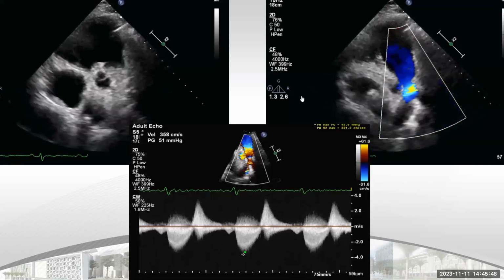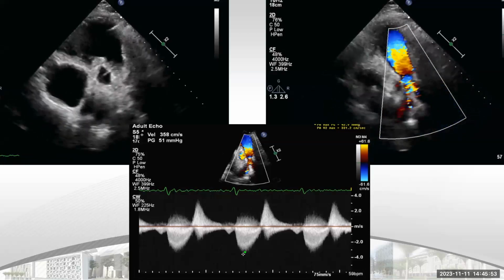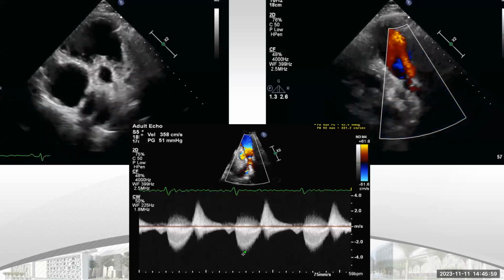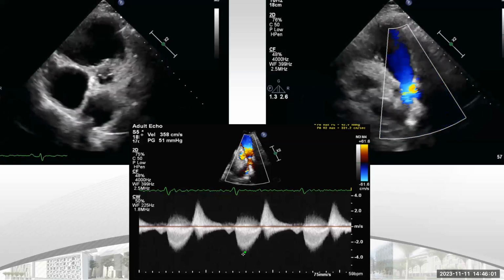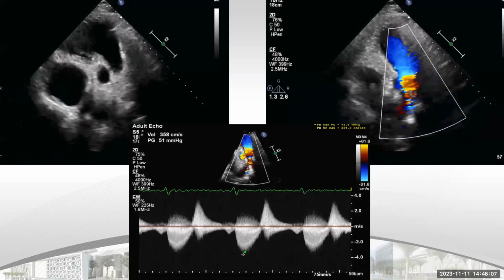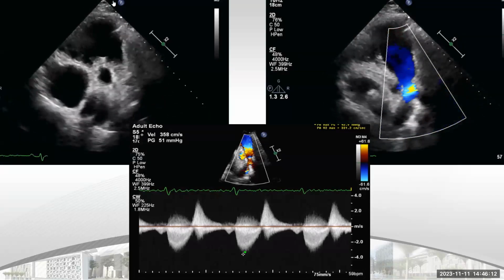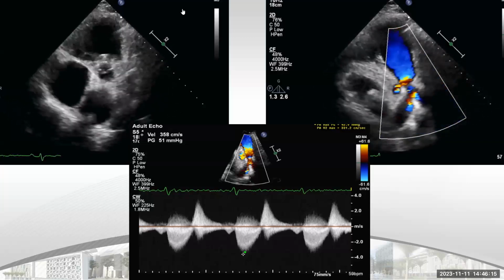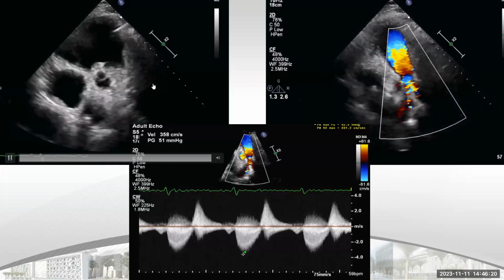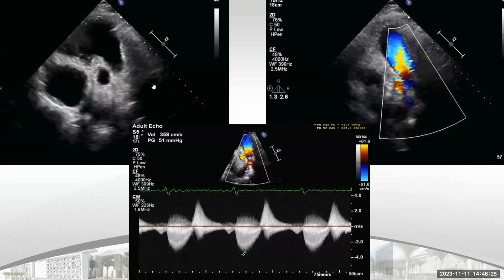This is a short axis across the aortic valve level. Please, I need a full answer, also four answers.